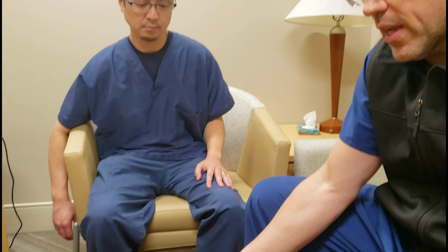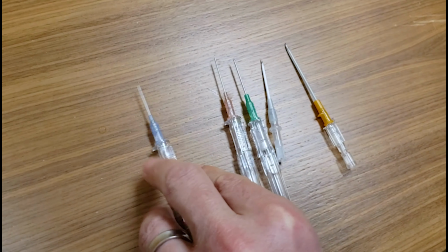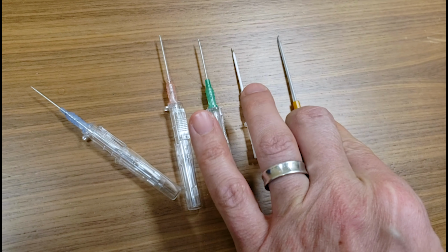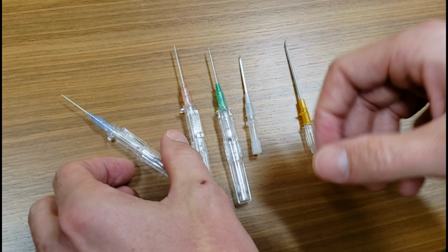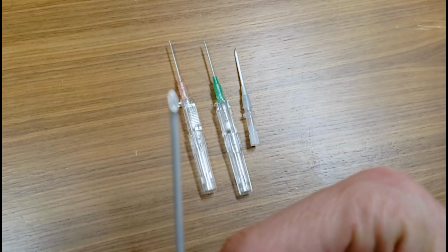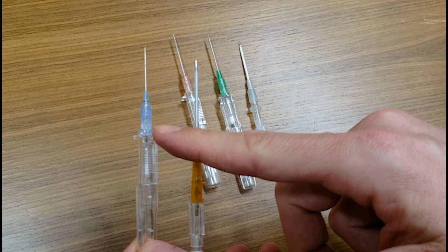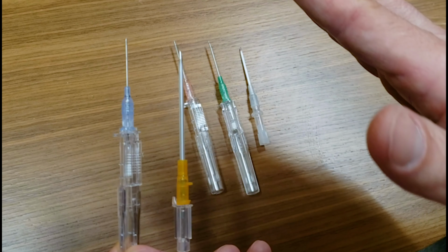So let's take a look at the different sizes here. We have a 22, a 20, an 18, a 16, and a 14. When people think of these IVs, they probably think that the only difference is the size of the bore. So this is the 22, which is the smallest bore here, compared to the 14, which is the largest bore. If you put the 22 in, you can only get so much volume in somebody because of the small catheter. You put the 14 in, you get much more volume.